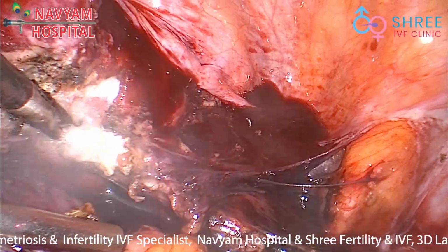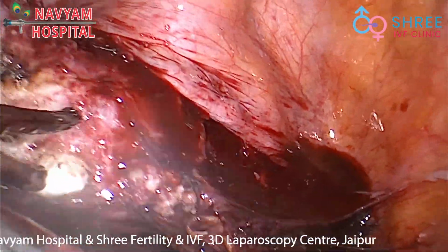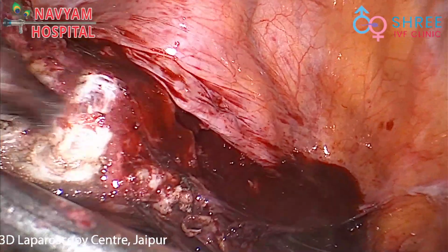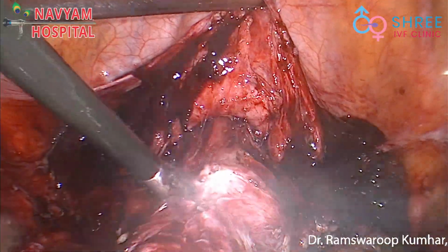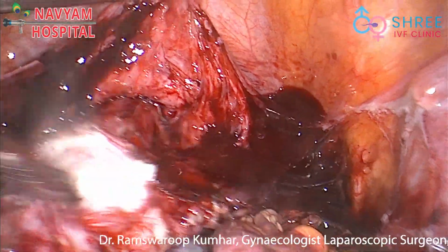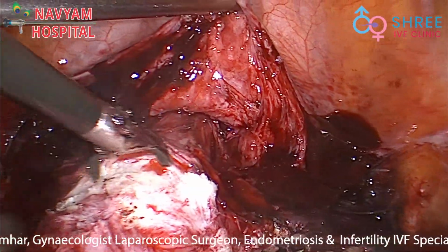Now we can see we have properly lateralized the vasculature bundle and we have to start the cutting of the vault. For this case, we started the vault cutting on the anterior side and then we extended it circumferentially to detach the uterus completely from the vagina.